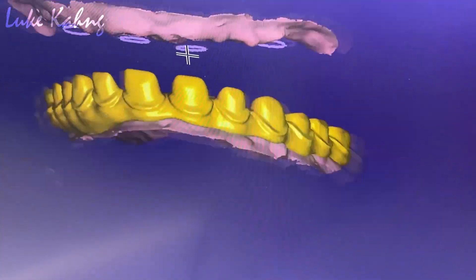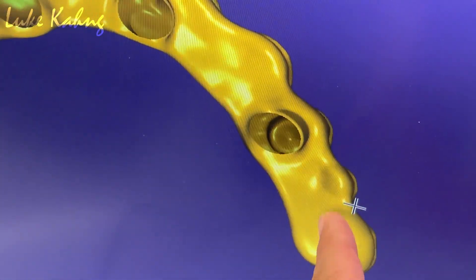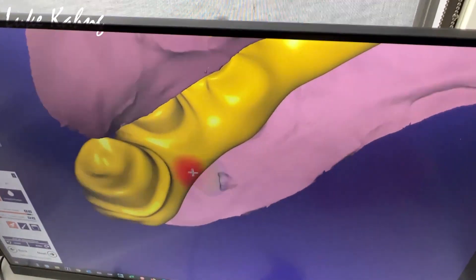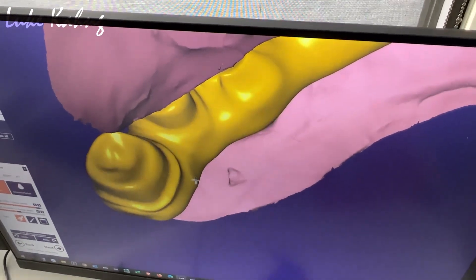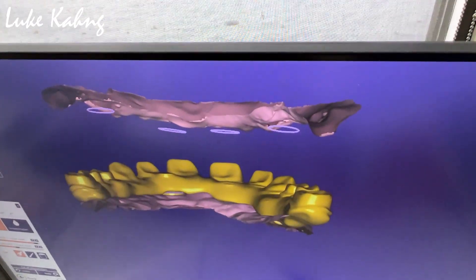Underneath one more time — okay, so here you could still cut it more. That side too, underneath — I'm talking about the lingual side. Yeah, okay, so we're going to trim it all right. This is our trim.